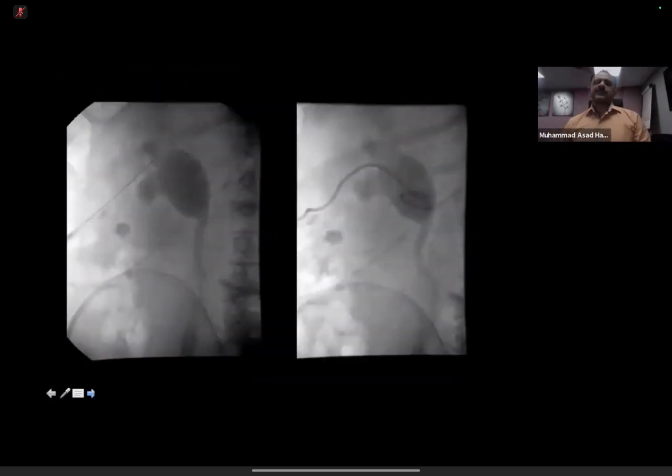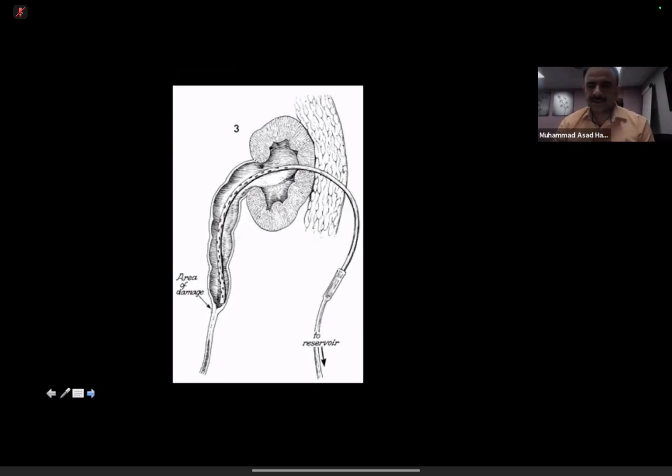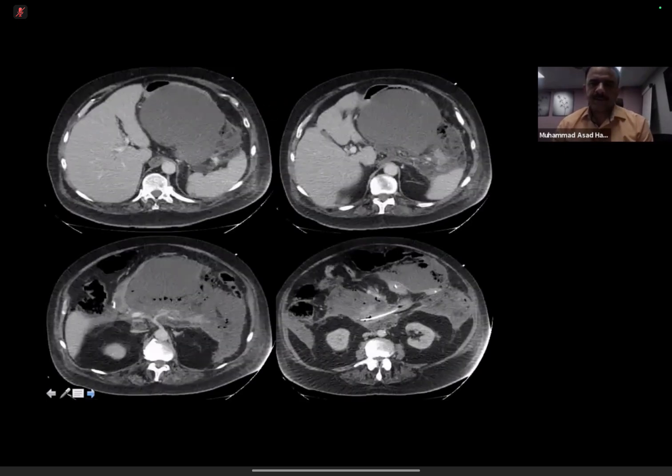And yes, nephrostomy is just like any other drainage procedure. Seldinger technique, it's normally performed under fluoroscopic and ultrasound guidance. Ultrasound is there to get your needle into it initially, and then you follow the Seldinger technique to basically deploy a catheter. Okay? Just view the images there. Next case for you. Okay? Can you please describe your findings in this particular patient?